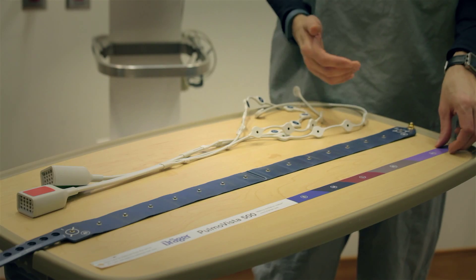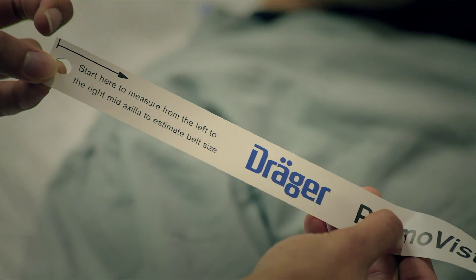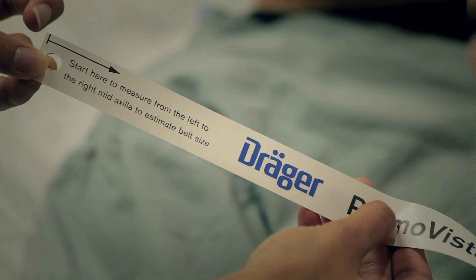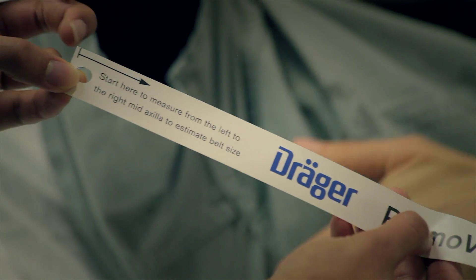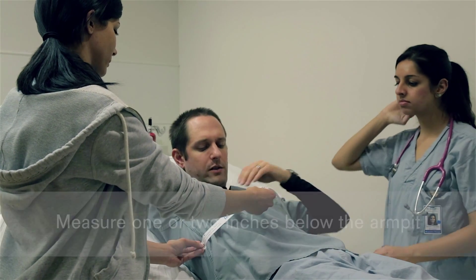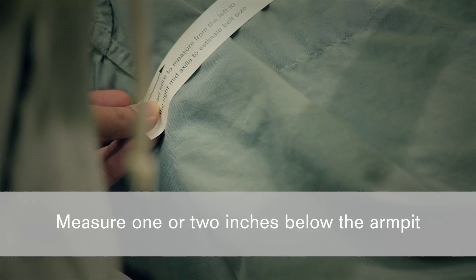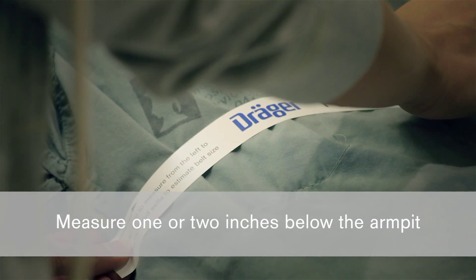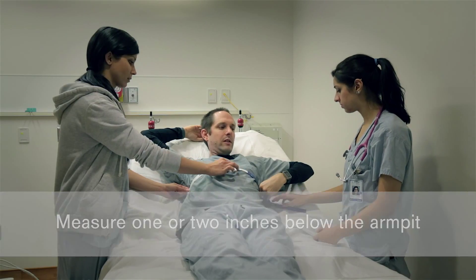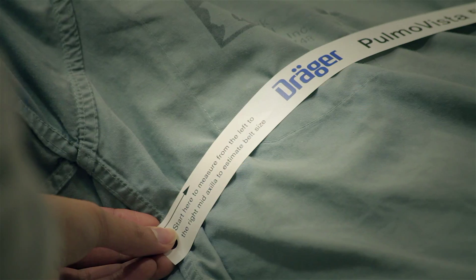When you first assess your patient, you're going to have used the tape measure to determine the proper size. In case you're not sure where to measure, it says it right on the tape measure. So right mid-axilla — apply there, then straight across, going about one to two inches below the armpit. You would do this on a patient's bare chest, pulling this down and looking at mid-axilla on the other side.